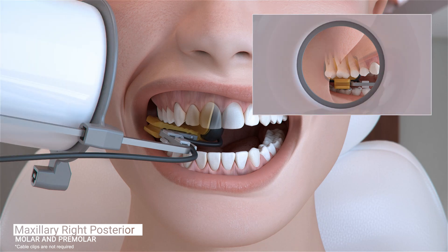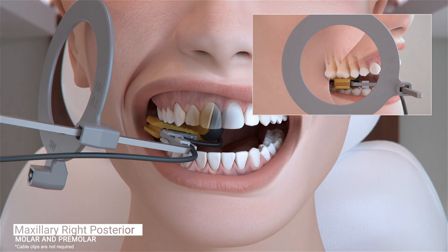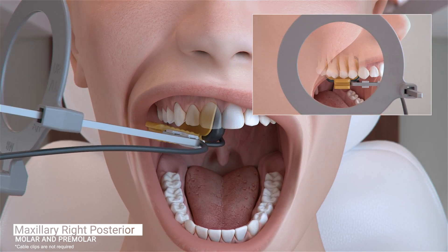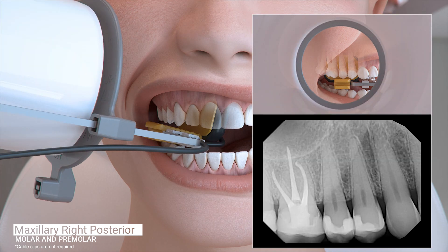The cone of the X-ray emitter must be placed flush with the aiming ring and then trigger the exposure. Ask the patient to open slightly and gently slide the sensor forward so the contacts of the first and second premolars are centered on your sensor. The sensor should be placed far enough forward to capture the distal of the canine. Ask the patient to gently close, position the cone of the X-ray emitter, and trigger the exposure.